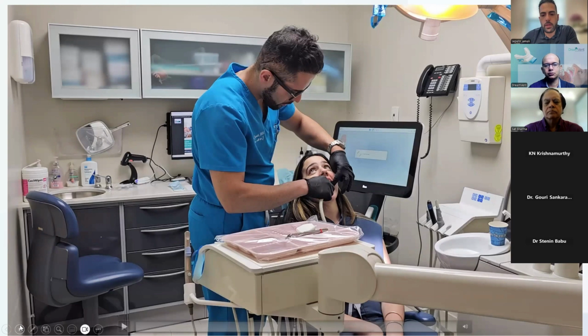Here we also have a video of the scanning. It's a little bit boring at the beginning. I'm just using my iTero Lumina scanner to scan. There are a few factors to take into account for proper scanning.